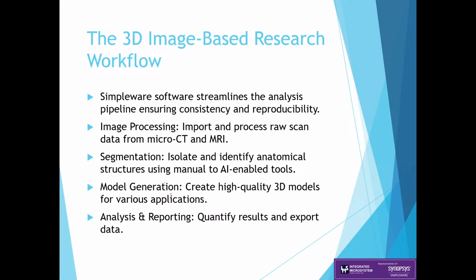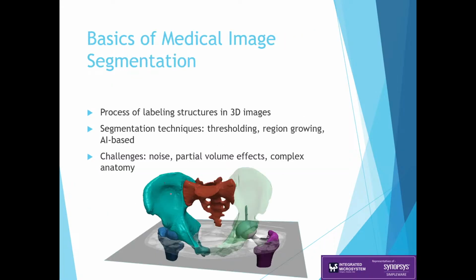Now, how to identify different parts in image processing is one of the foremost important things. Whenever we are considering an MRI data set, we generally prefer soft tissue segmentation. Whenever we are considering a CT data set, we prefer orthopedics data sets to be segmented. Then, what are the basics of medical image segmentation? The first and foremost part, if we are using semi-automated approaches, is to identify the region using a thresholding-based approach.